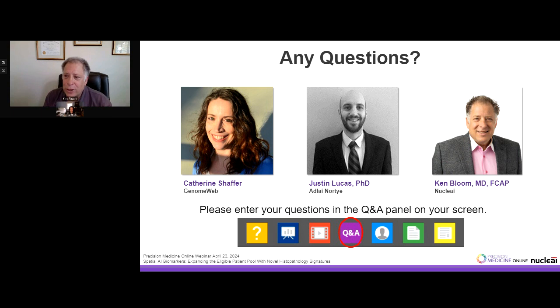But that's a question that you want to ask of your AI models: how generalizable is it? And it really means what's the robustness of your training? Have you trained to the full extent of tissue that you might see? So we've done that and published on that for things like different PDL1 clones run on different instruments, scanned with different scanners, and shown the robustness of that between stains, for example, like SP263 and 22C3.